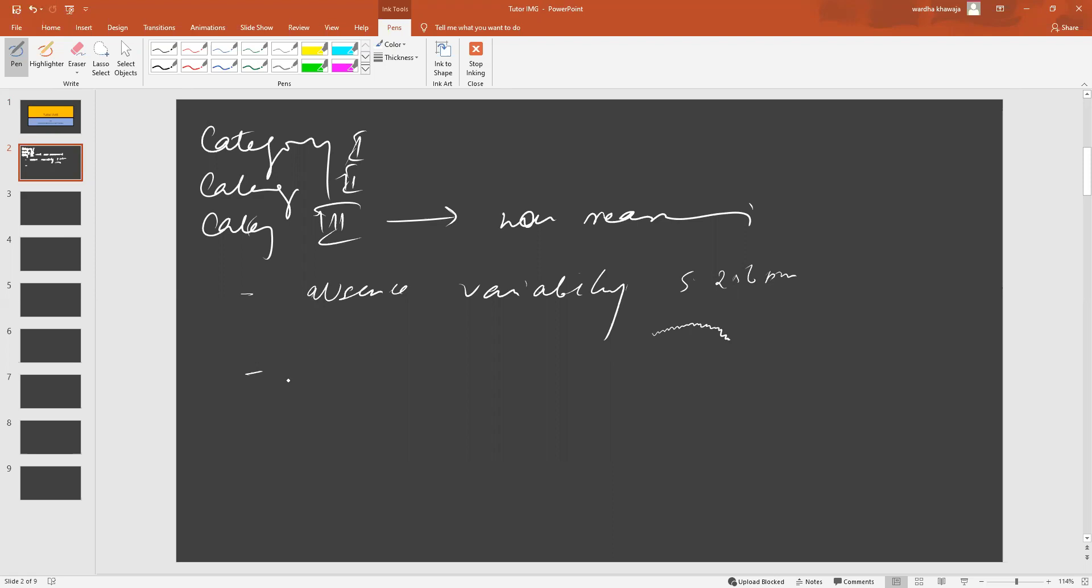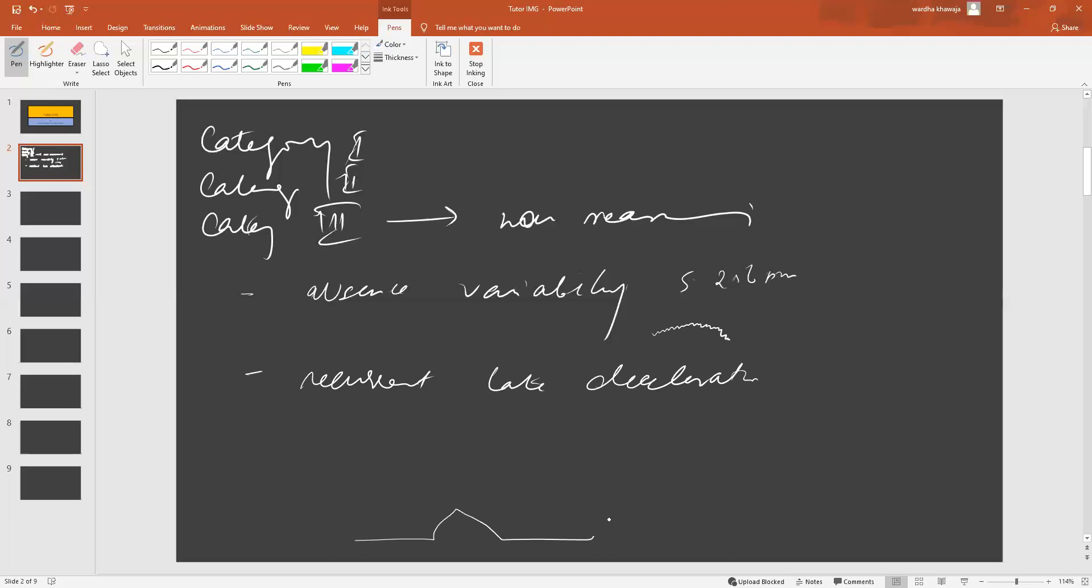When we consider the second component of category 3, we talk about recurrent late decelerations. What do we mean by these? Usually, on a fetal heart rate tracing, at the bottom, we have the maternal contractions. When the maternal contractions peak, the baby's heart rate should fall at the same time.